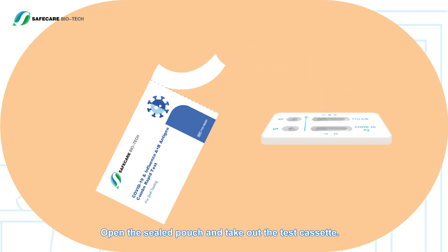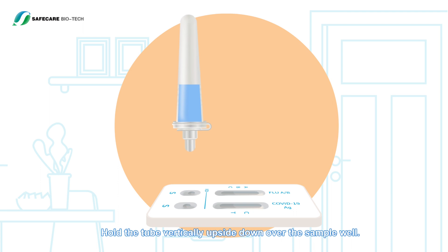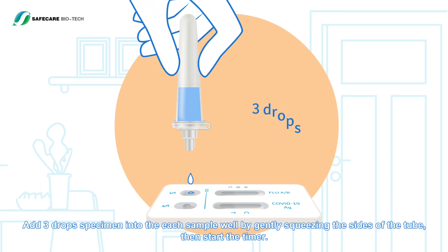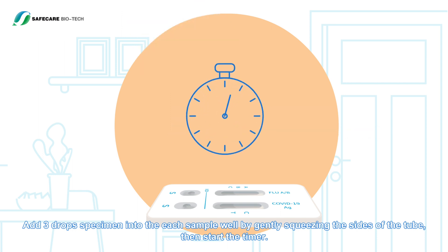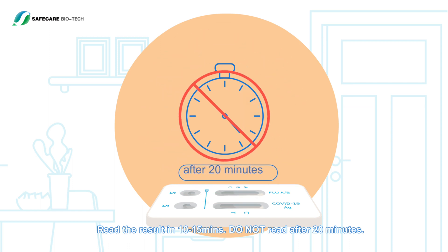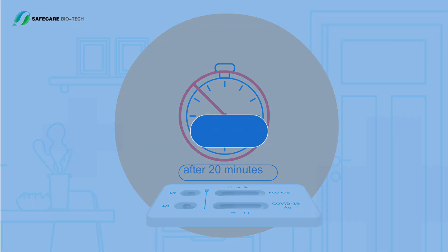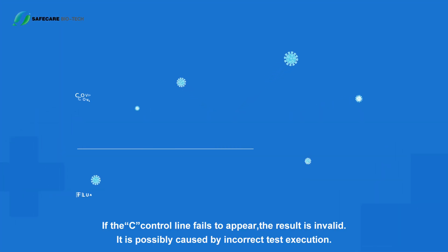Test procedure: open the sealed pouch and take out the test cassette. Hold the tube vertically upside down over the sample well and add three drops of specimen into each sample well by gently squeezing the sides of the tube. Start the timer and read the results in 10 to 15 minutes. Do not read after 20 minutes.